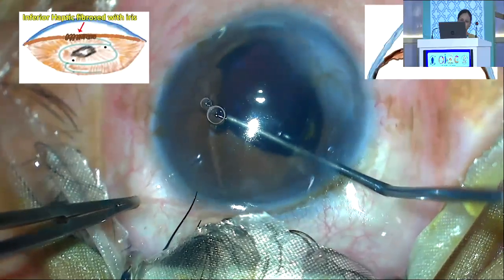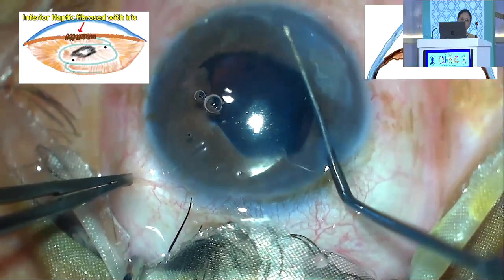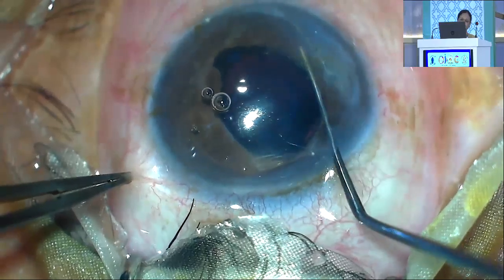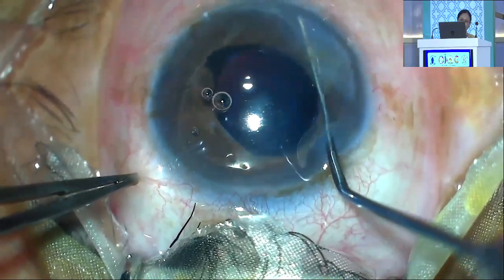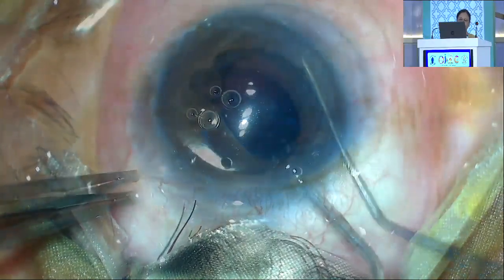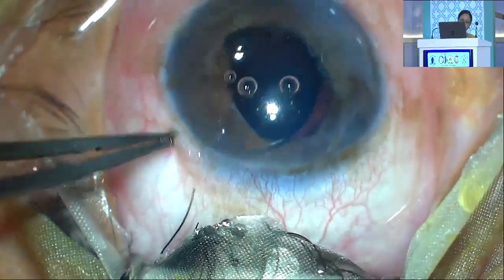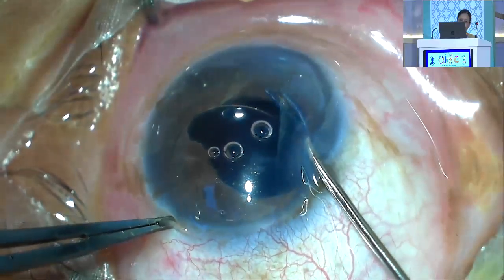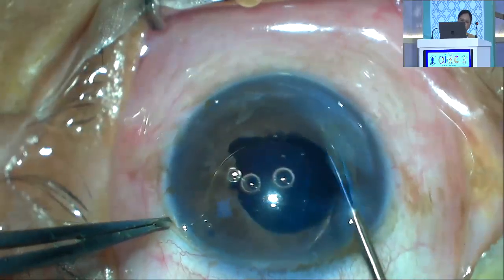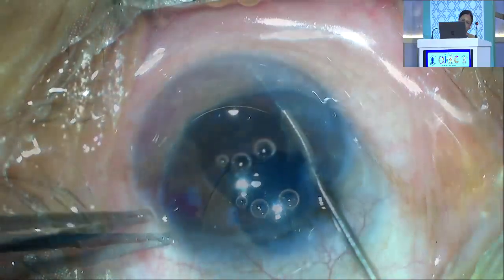But on rotating the IOL further, it was noticed that the lower haptic had perforated the iris and was densely fibrosed with it at the inferior angle. But repeated dialing remained unsuccessful. After injecting a little viscoelastic, pulling out the haptic from the entanglement with a microforceps could not help. Rather, a great traction caused an iridodialysis along with fresh hemorrhage from the angle.